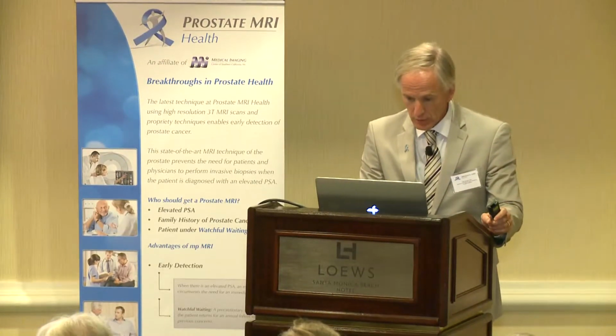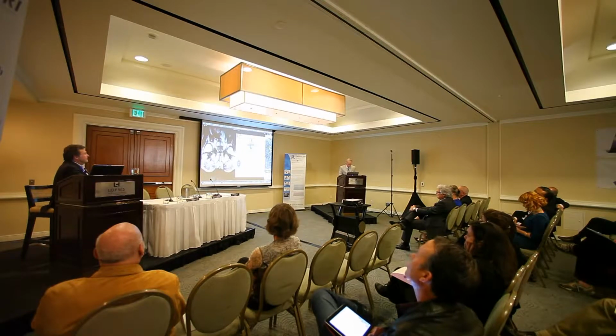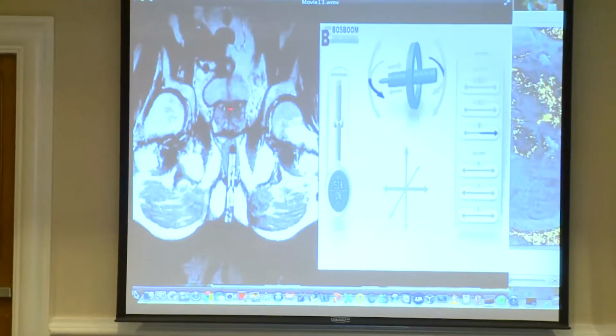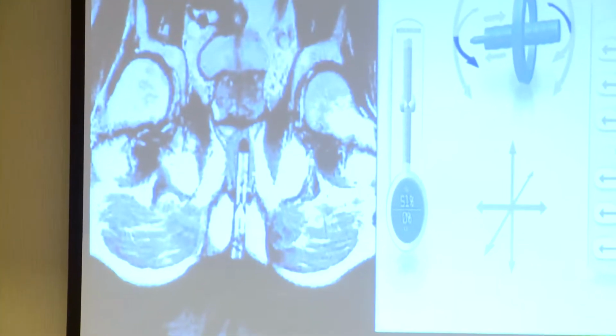Whoops, I go back a bit. I can show you how it works. Remotely you can see the stick move from one side to the other side. I will repeat it again. You can see it move. You press a button and you can just steer it. This is the stick, and we are targeting the stick towards the prostate lesion over there. So let's go back now to the presentation.